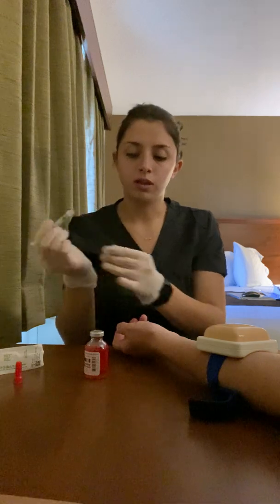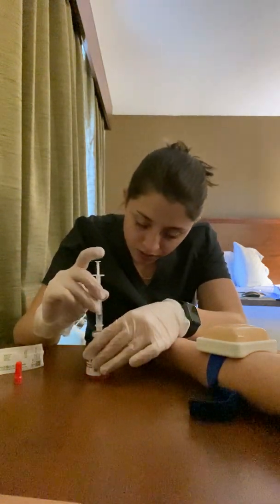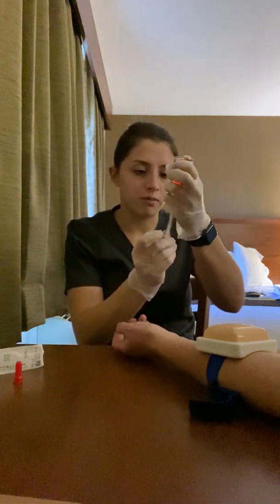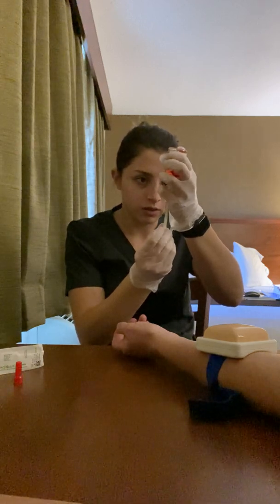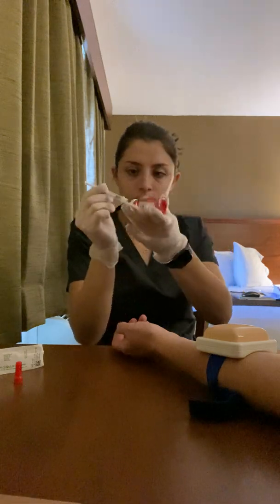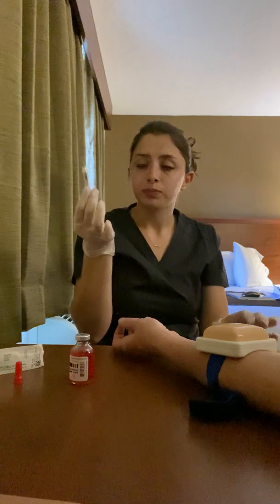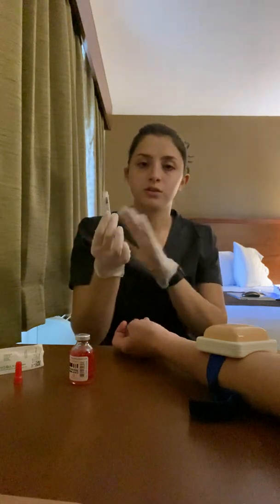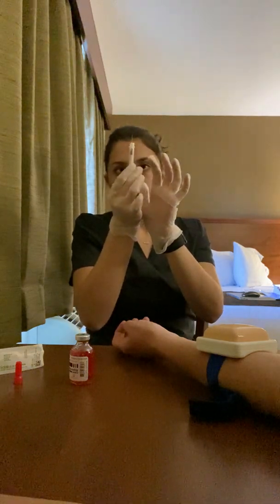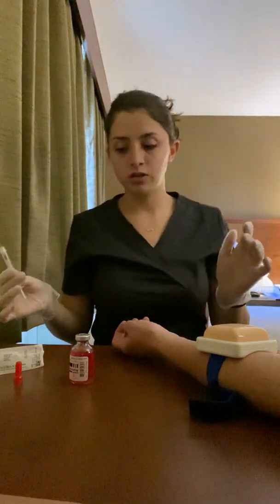Okay, it's at 0.1 milliliters. Now I'm going to inject the 0.1 milliliters of air into the vial. And I'm going to invert it and pull 0.1 milliliters of fluid into the syringe. I have 0.1 milliliters in the syringe, and the order calls for 0.1 milliliters, so I've verified the dose. I'm going to make sure there's no air, and it's still at 0.1 milliliters, so it is the correct dose.